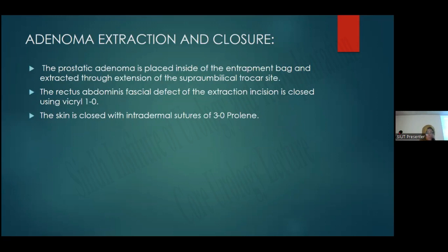Adenoma extraction is done through the supraumbilical trocar site. If needed, it can be further extended. Then the closure is done with Vicryl 1-0. The rectus abdominis fascial defect is closed, and the skin is closed with 3-0 Prolene in an intradermal fashion.